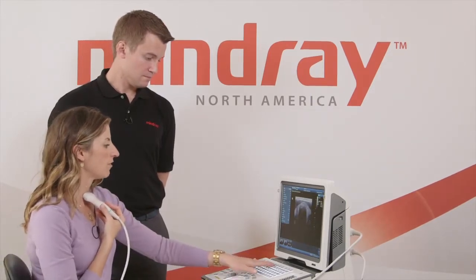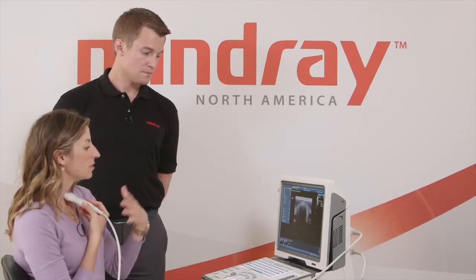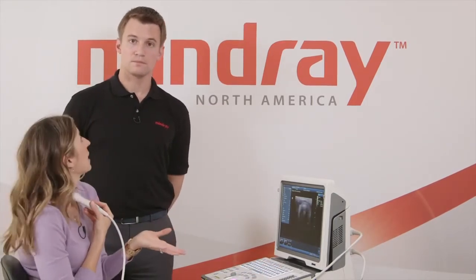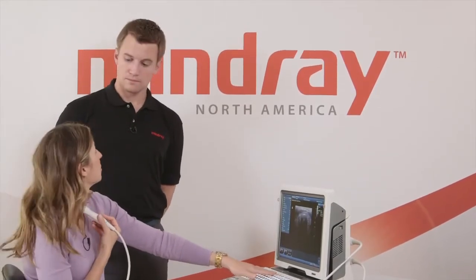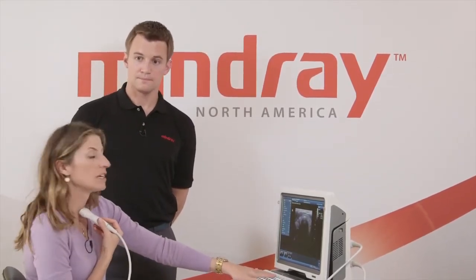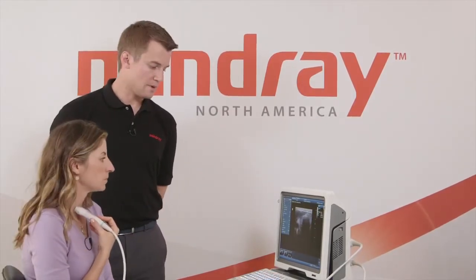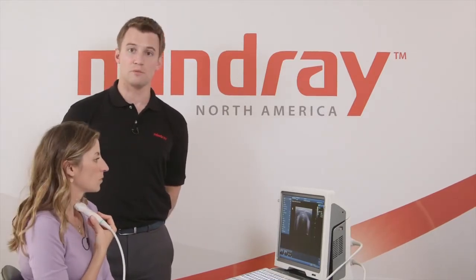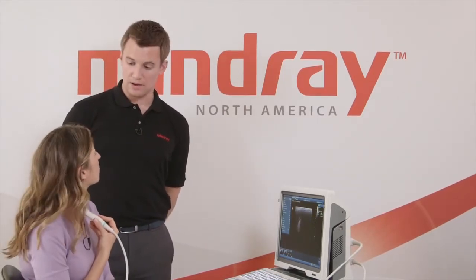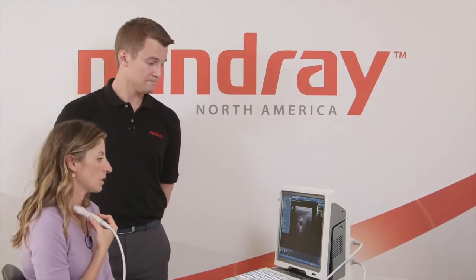Are all of these function keys programmable as almost quick keys, and depending on what the account would like during the system setup, you can have your applications person over the phone walk you through how to set up those specific keys? Yes, they are. When we discuss the setup portion, we'll talk about how those F keys are programmable. They are in the manuals, and they're also very easy to discuss over the phone. That's really nice.